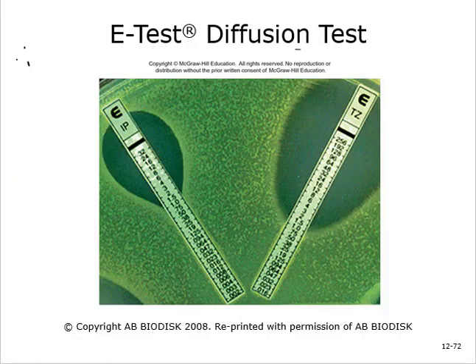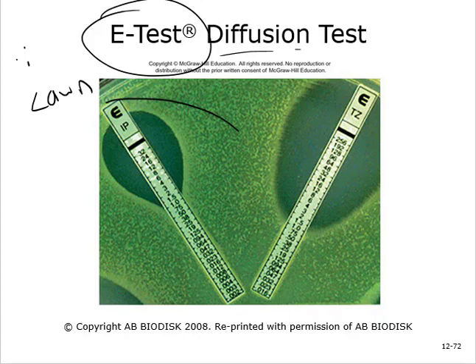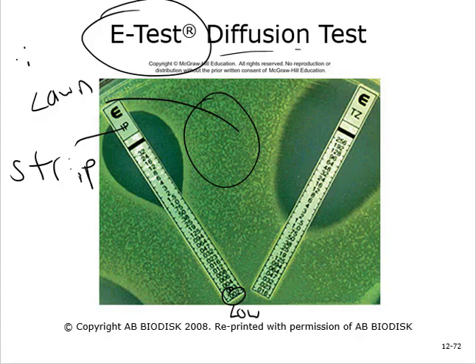Our next test to talk about is called an E-test, which is also a type of diffusion test. It's kind of similar to the Kirby-Bauer test. Again, you take a plate and you create a lawn of the bacteria. You spread the bacteria all over the plate, and you can see the bacteria here growing. Then you take a strip coated in a specific antibiotic. Down here at the bottom, you start with a very low concentration of the drug, and then as the strip goes on, the concentration increases to a very high concentration of the drug.